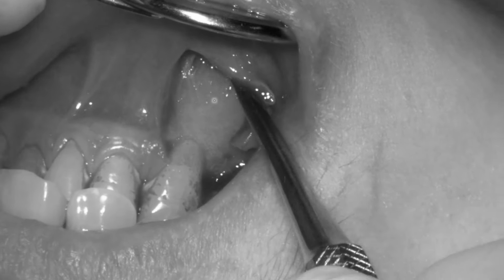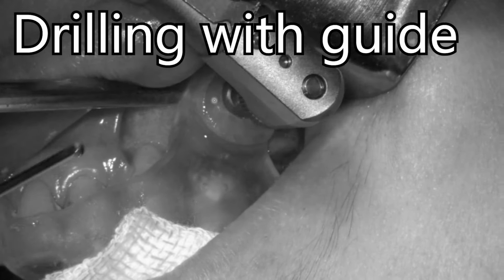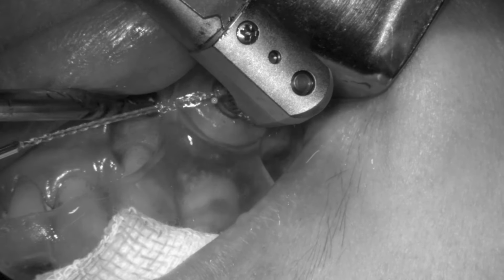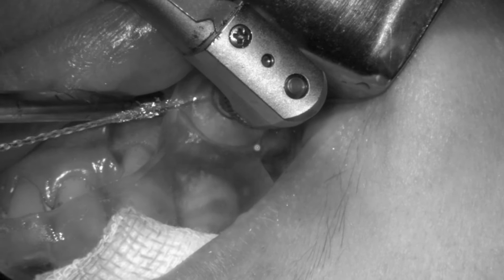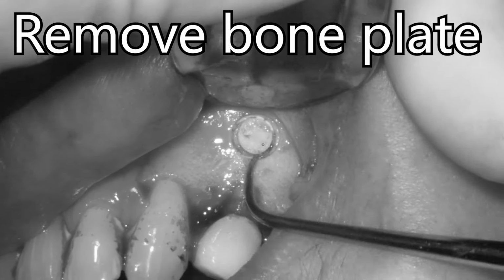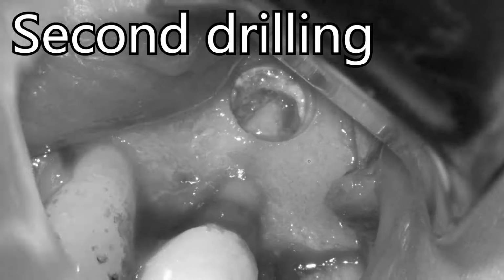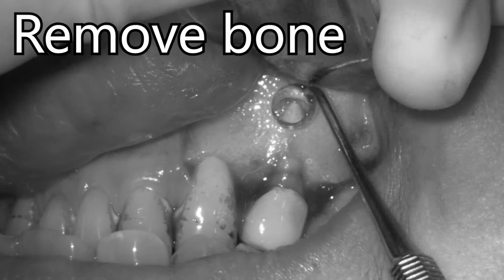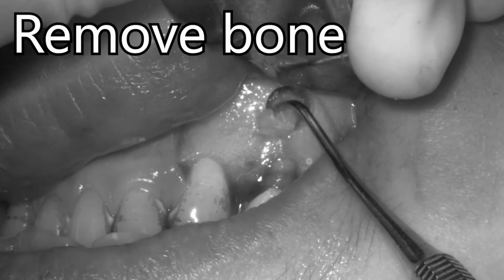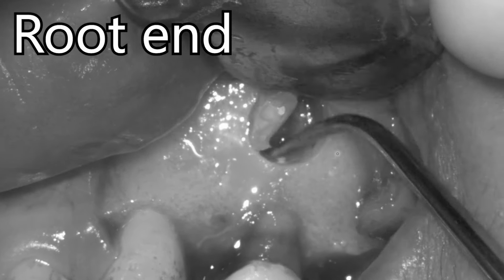And this is the flap reflection. In this case, I specially designed the guide to attach on the bone directly rather than soft tissue. There is no gap between the printed guide and the bone surface. And I removed it with the trephine bur. So this is the reason why I designed a surgical guide, because there's intact buccal bone that after flap reflection you might need to find.